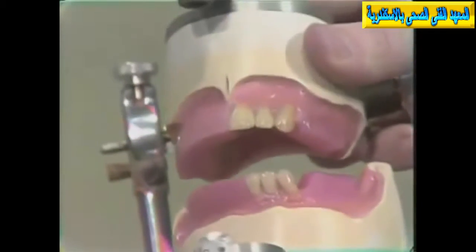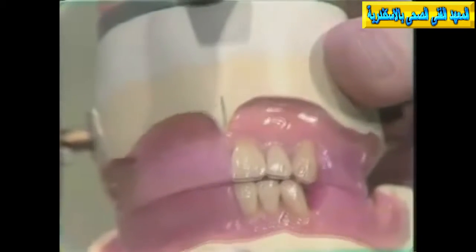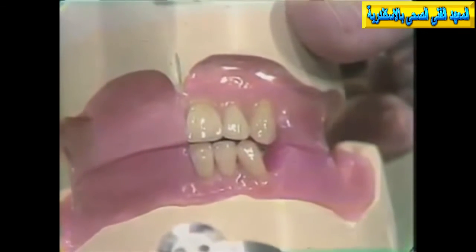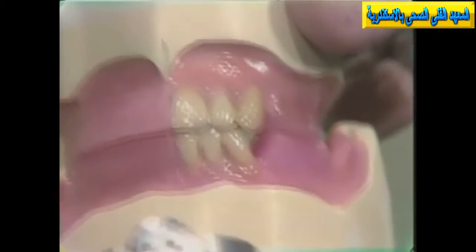The horizontal and vertical overlap is maintained. The maxillary lateral incisor was placed 1 millimeter above the occlusal bite rim. Thus, the vertical overlap in the central incisor area is 0.